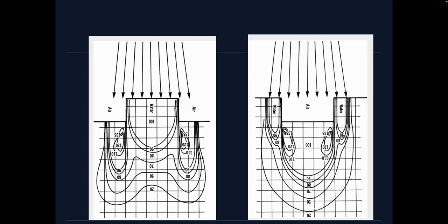And this is very important when we are talking about chest wall radiotherapy. It is of extreme importance to review exactly what kind of difference there is in depth in the isodose line. There are a lot of chest walls where you can see a lot of irregularities after the operation and you don't really know what to do about it. So please discuss it with your physics team and don't use it in a simple way, because the outcome may be catastrophic.